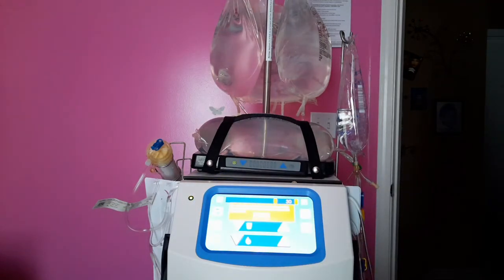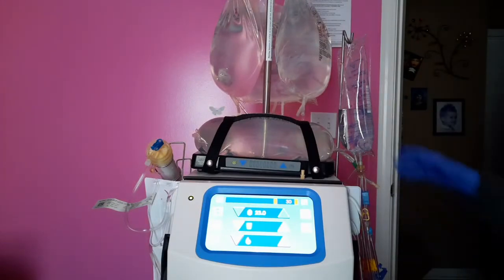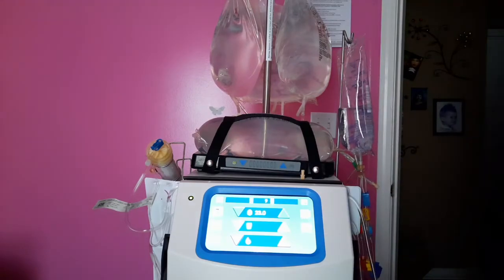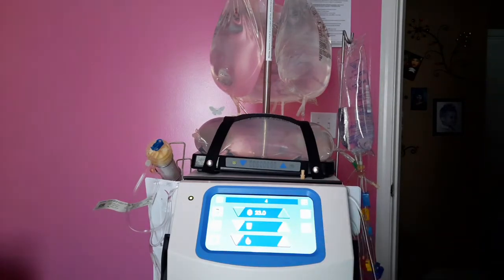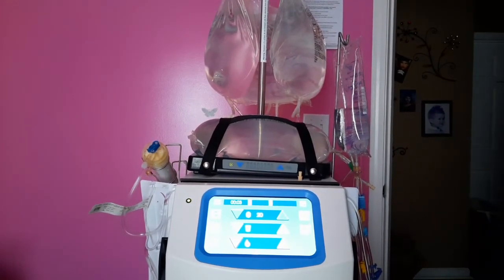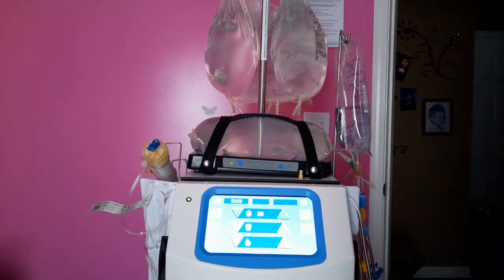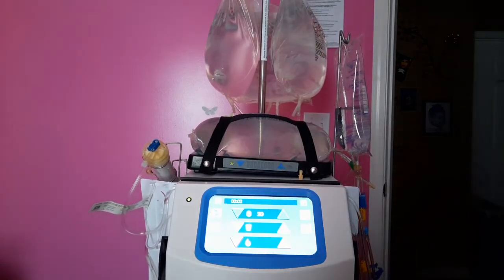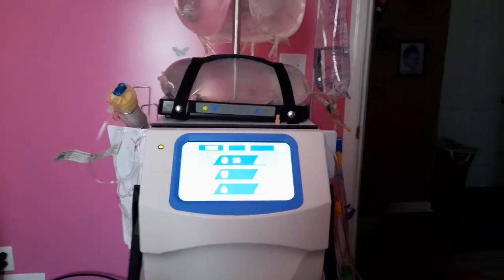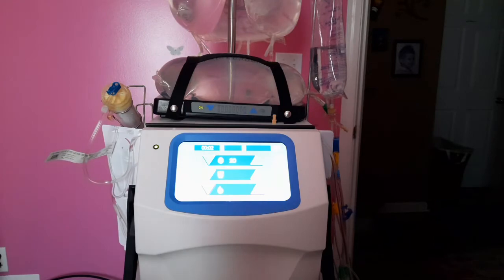It says, check blood circulation, venous pressure high during prime, including recirculation, step 23. So mute that. It's recovering. Okay, so it's got 3 minutes, rechecking itself. Evidently it detected some kind of pressure or air pressure in one of the lines when I snapped and tapped, and that's exactly why we snap and tap, folks. That's exactly why. So it's doing a systems check again. I got it going.